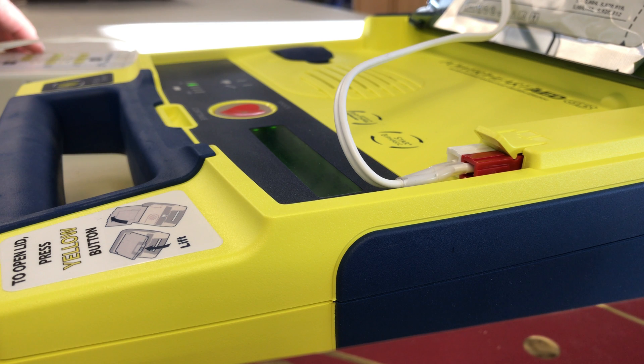Begin by exposing the patient's bare chest and torso. Remove or cut clothing if needed.